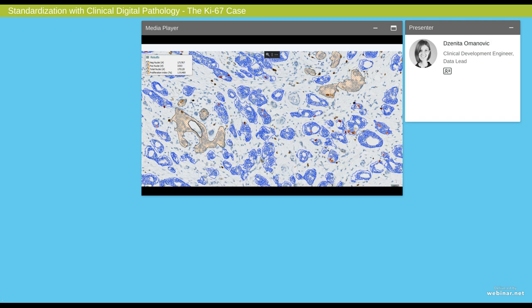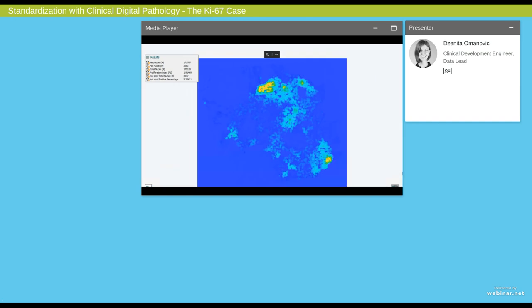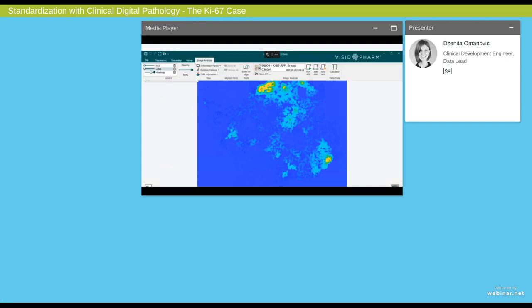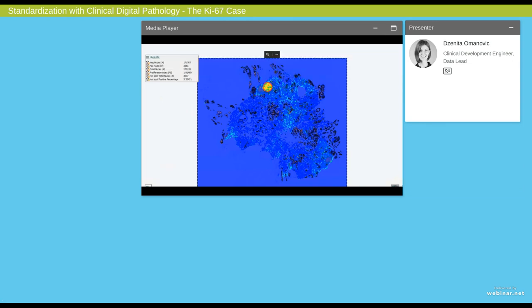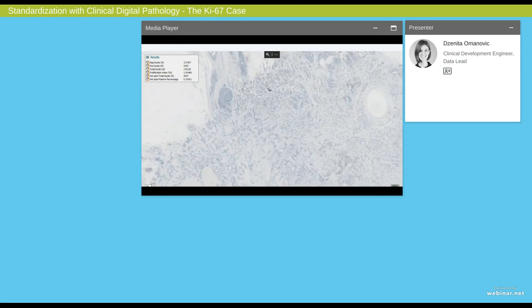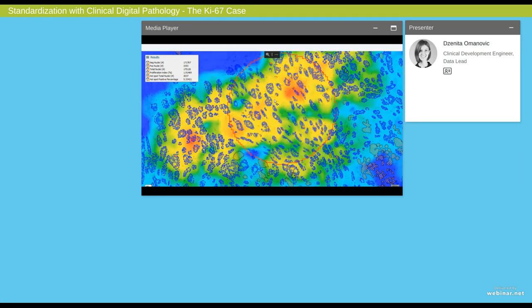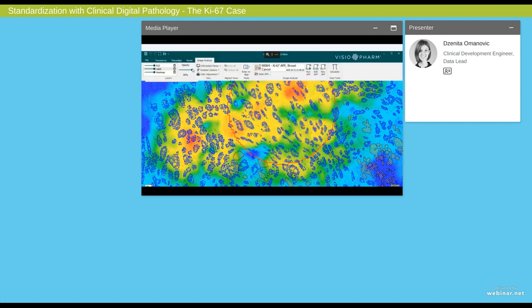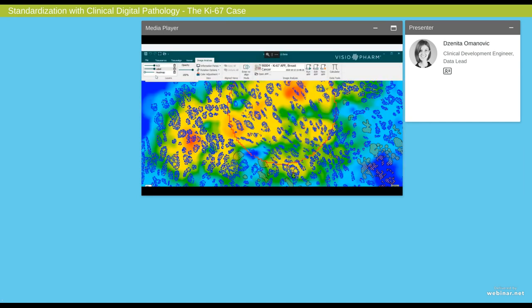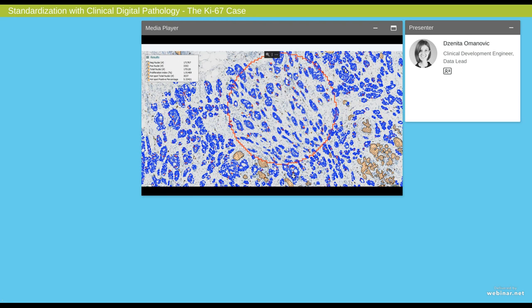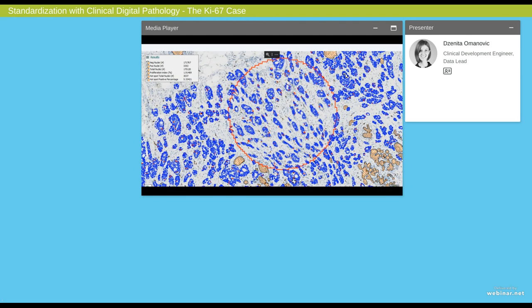Now, apart from just doing a global KI-67 scoring, we can also do a hotspot KI-67 scoring. To do a hotspot KI-67 scoring, we use our hotspot app that firstly goes in and creates a heat map that shows us where the highest concentration of positive KI-67 cells are. We can see that we have some action in the bottom right corner and in the top left corner. Based on this, we can then place a hotspot. Here we have decided to place a hotspot that fits with a 20x microscope field of view. But since there is no consensus on how a hotspot should look like, we have developed the app so that you can create the hotspot definition you find most appropriate. If we look at the results, we see that the hotspot has a proliferation index of 5.3%, whereas the global score was 1.9%.